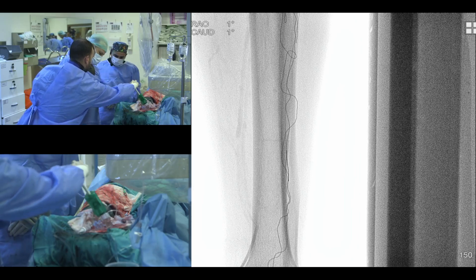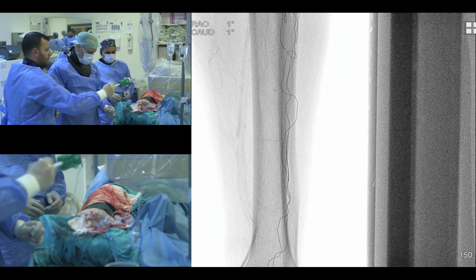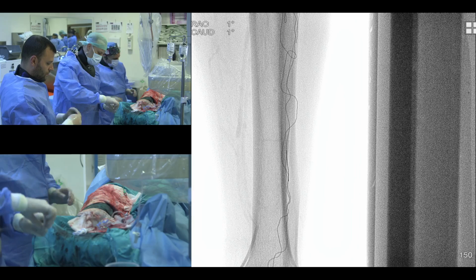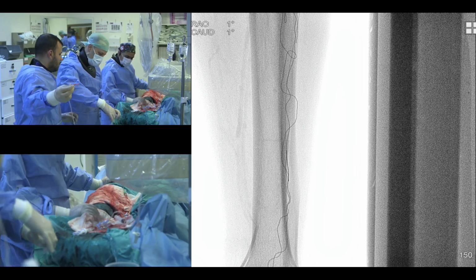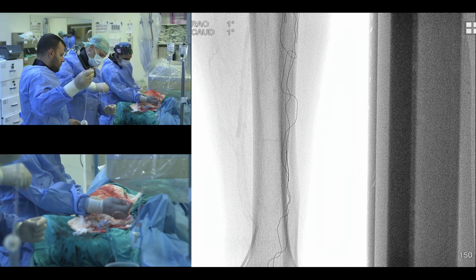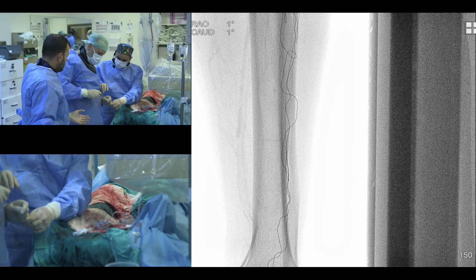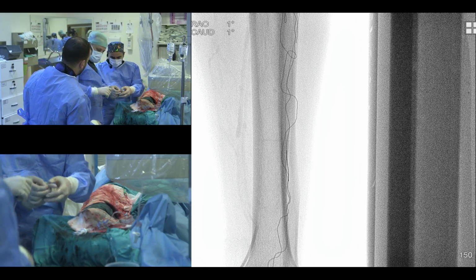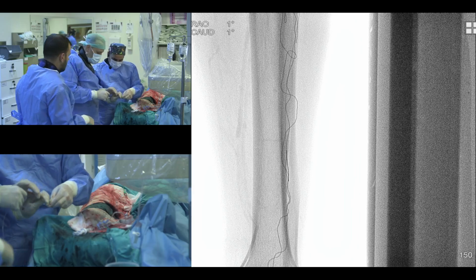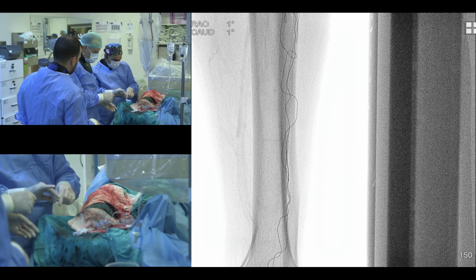So this is why I like MRAs. So I'm going to stop this to show you. So this is his right leg, popliteal artery completely occluded from the proximal area. And let me stop this one and show you. So now there's venous contamination. So the quality of MRA, if you don't time it properly, you will get venous contamination. So this is all venous contamination, but you can see the SFA is nice and clean. On the right side, the popliteal artery, you don't see anything.